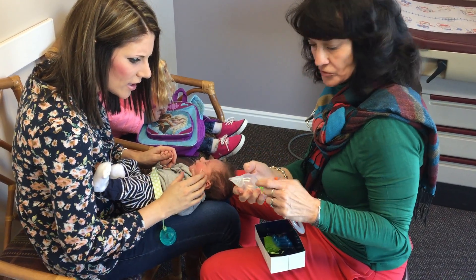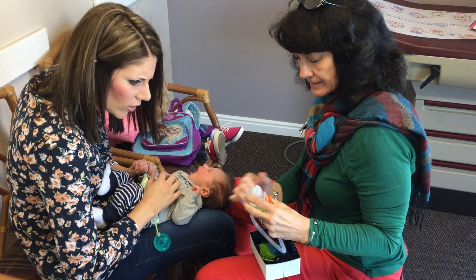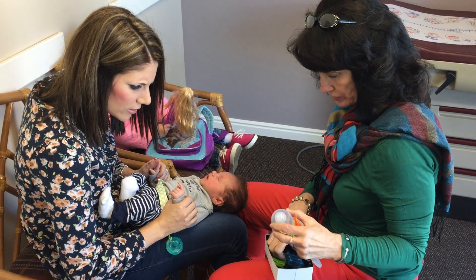So you put this in his nose — you don't need to squeeze it. Instead, you're sucking it out. And then it has these little filters. There are about six extra filters. If the filter gets dirty, then you just want to replace it.